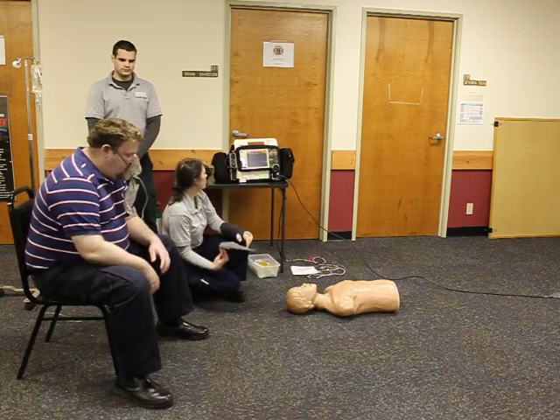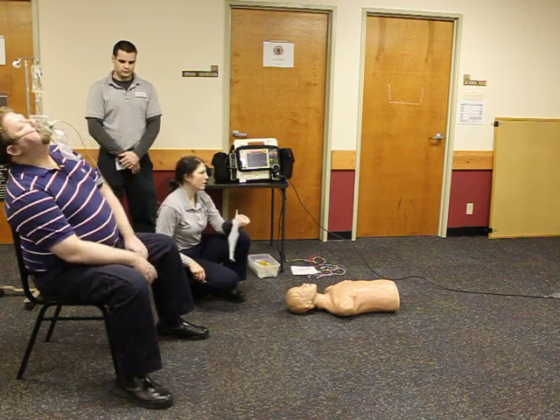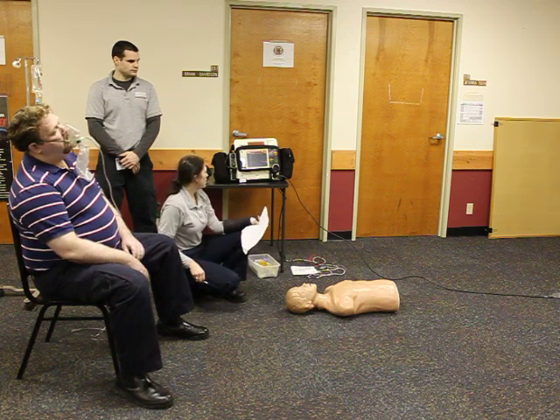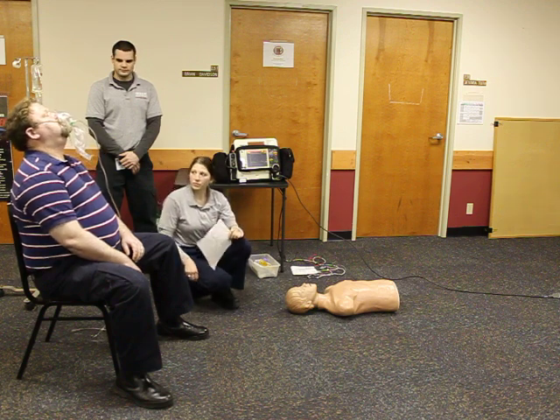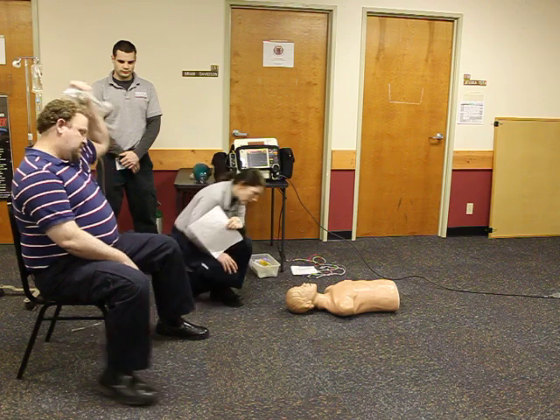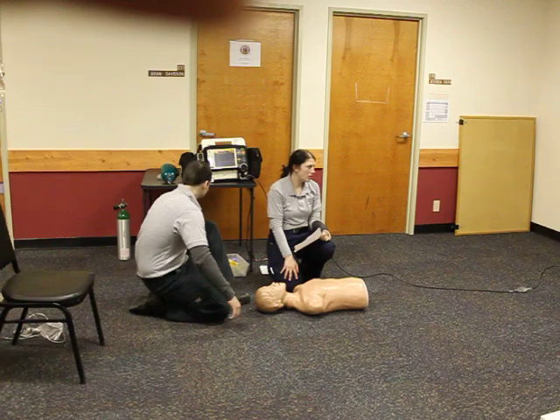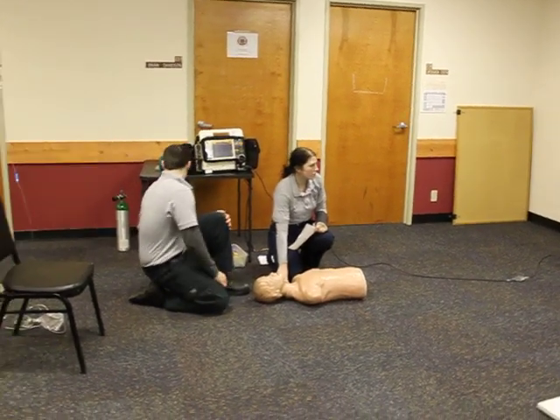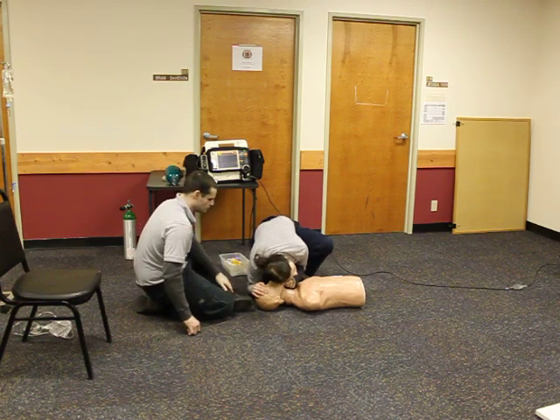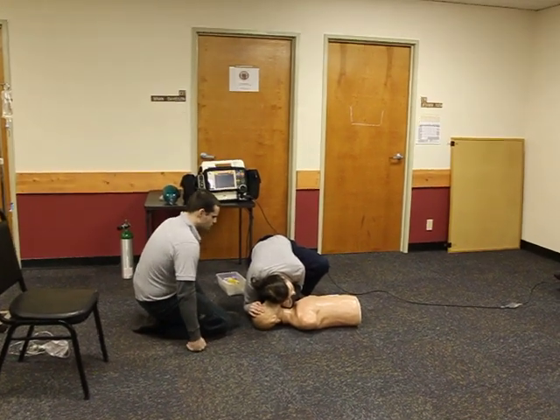I feel like I'm going to pass out. My patient looks like he's displaying signs of being unstable. What does the monitor look like? Still the same. Still see SVT. So my patient's LOC has changed at this time. I'd like to assess CAB for circulation, airway, and breathing. Does my patient have a pulse? He does. Going to open the airway, look, listen, and feel. Is he breathing? He is breathing. Rate and quality? He's breathing 10 times a minute and very shallow.